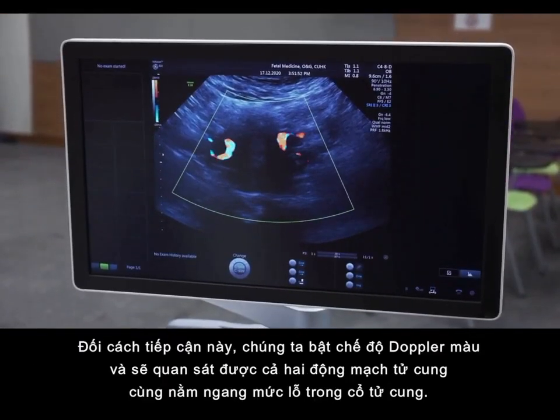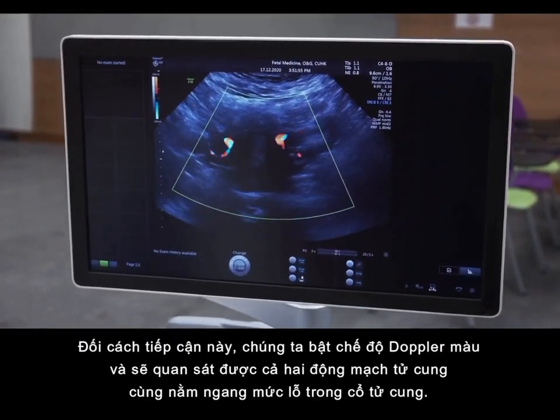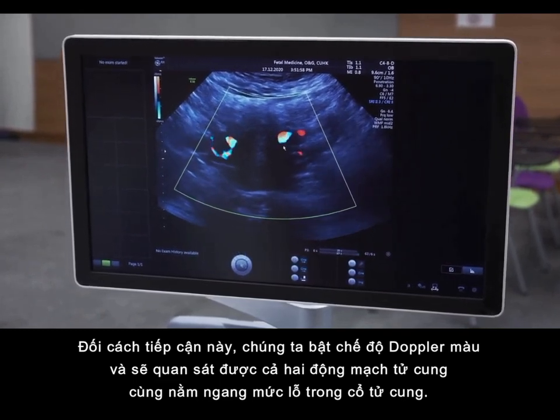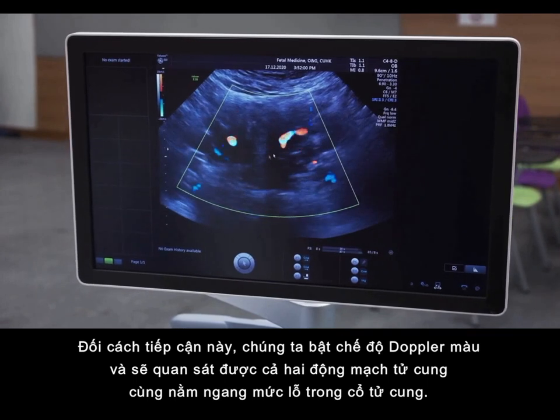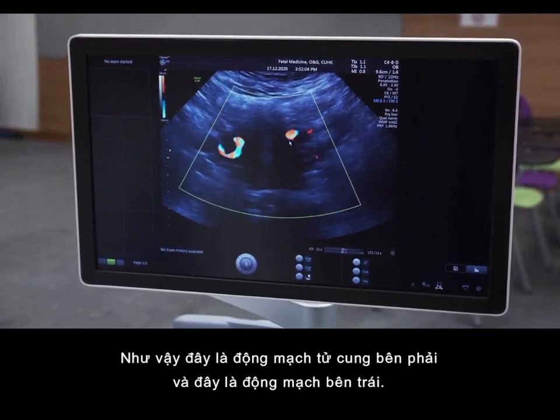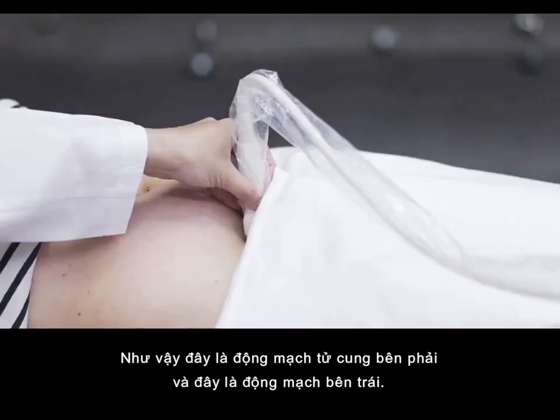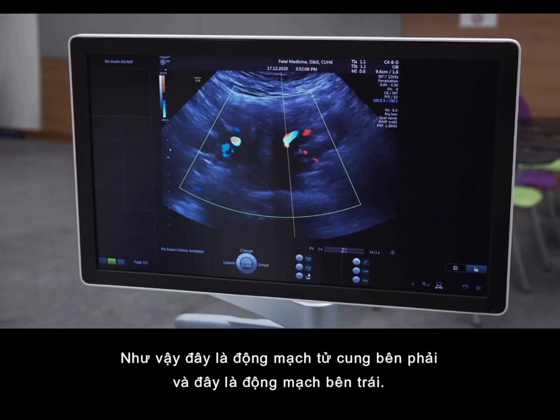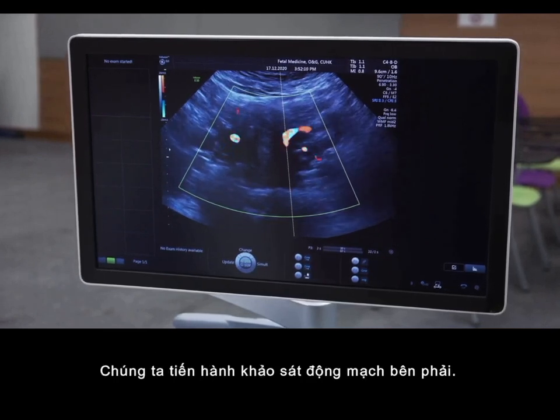So through the transverse approach, now you turn on color flow mapping. You'll be able to visualize both uterine arteries at the level of the internal os. So this is the right artery and this is the left artery. Now we measure the right uterine artery.